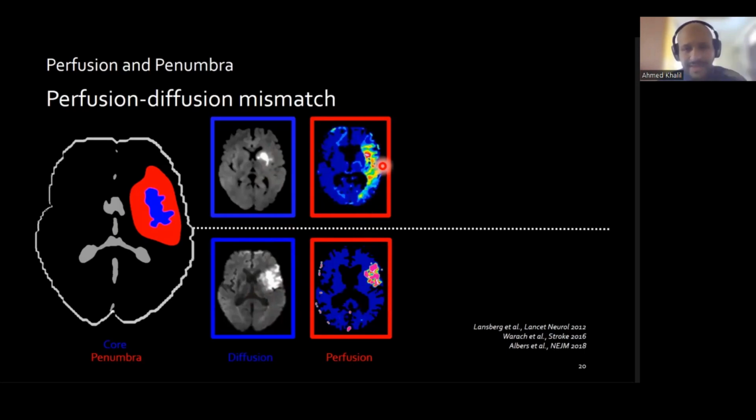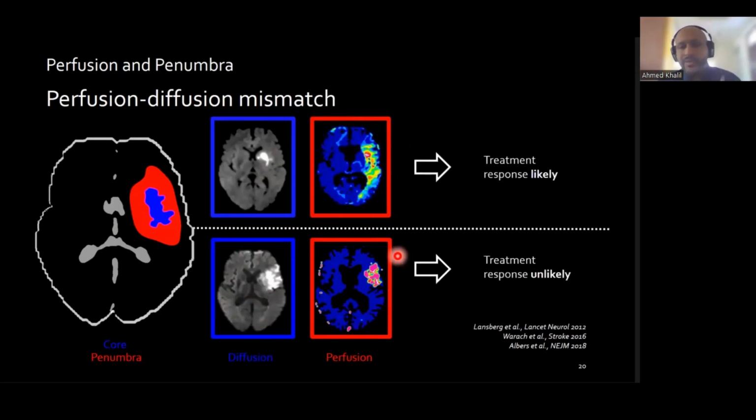And basically, the way this operationalization works is that this patient here is assumed to have a large ischemic penumbra, while this patient at the bottom is assumed to have none or a negligible ischemic penumbra. And this is important because empirical studies have shown that, especially in patients who present beyond the time window for stroke treatments like thrombolysis, thrombolysis, for example, is really only recommended, at least without advanced imaging, up to 4.5 hours after stroke symptom onset.